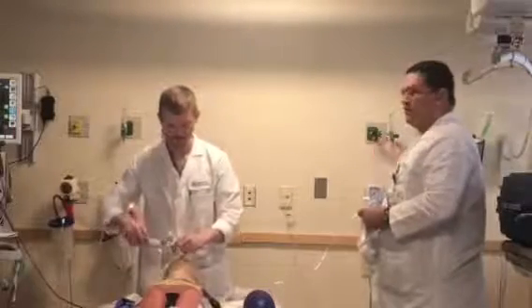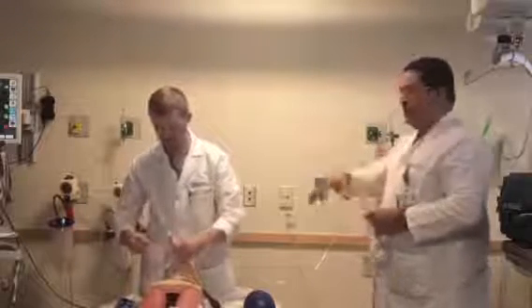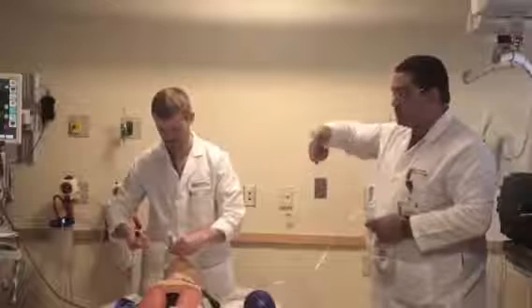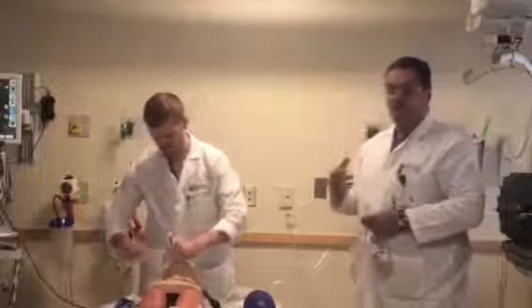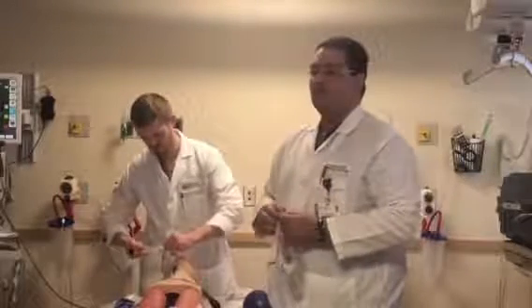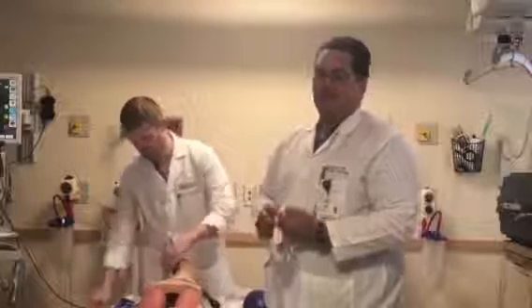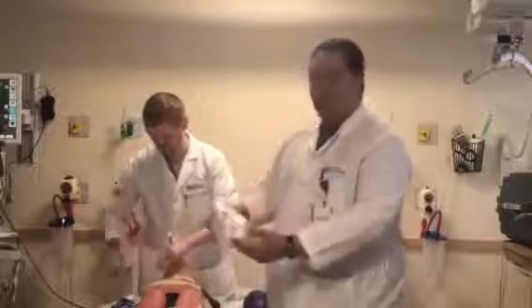Before the flow meter, right here, and use a gun. That gun gives you jet ventilation, basically. It accumulates CO2 a little bit, but it oxygenates the patient, right? If you don't have the gun, which most of us don't buy, it's ridiculous. You can make it quickly.